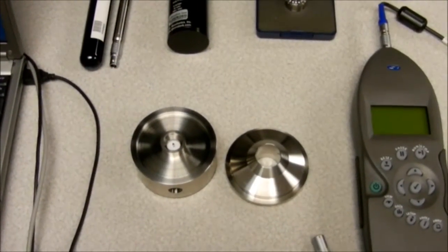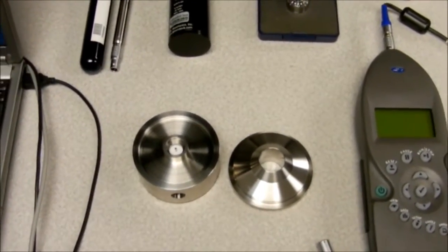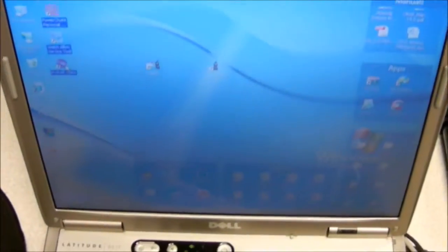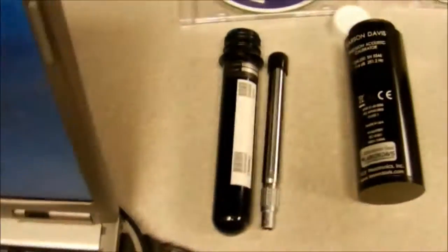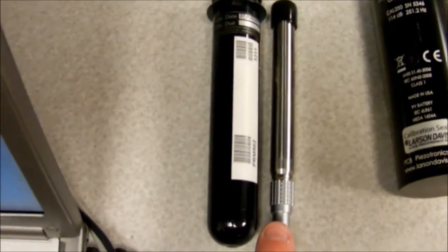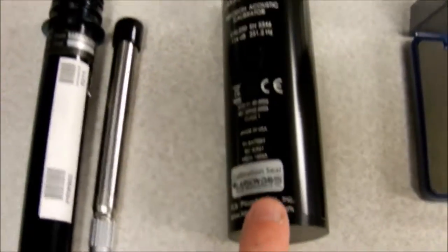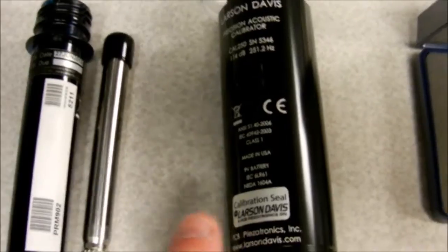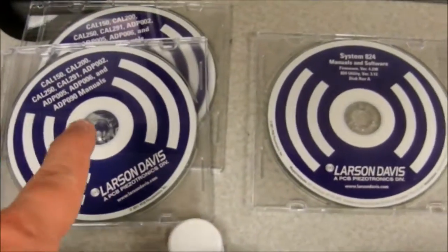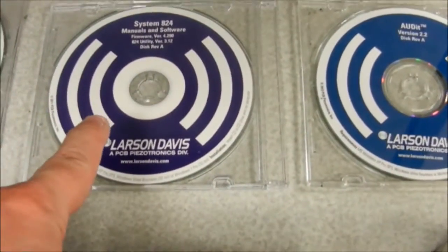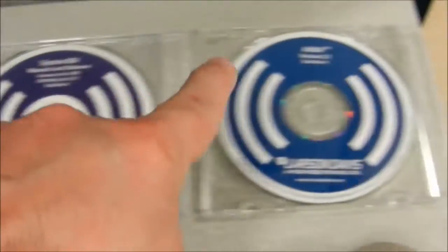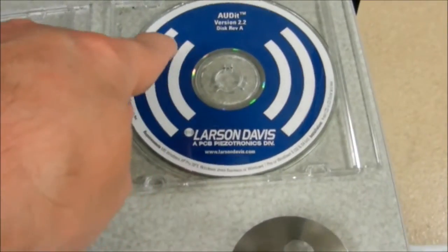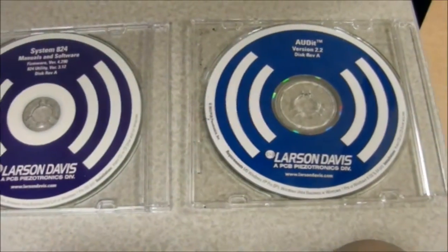Audiometer Test Equipment. Here we will need a laptop, the preamplifier, the Cal 250 acoustic calibrator, the manuals, the utility software, and the audit software that you will install on your laptop.